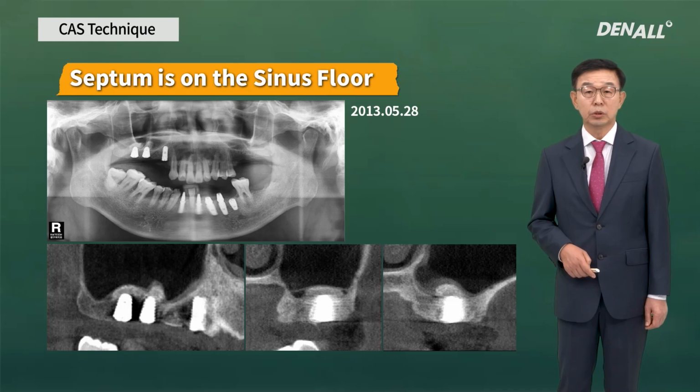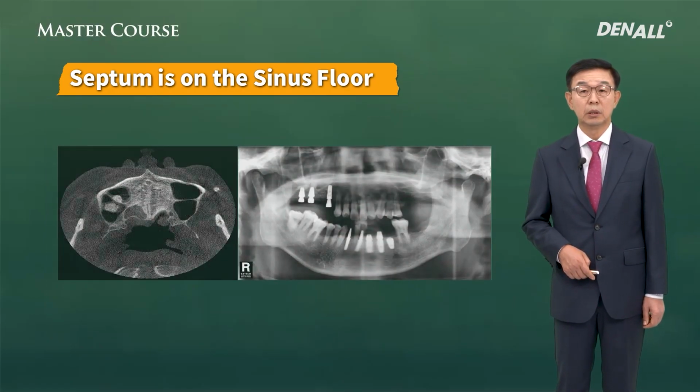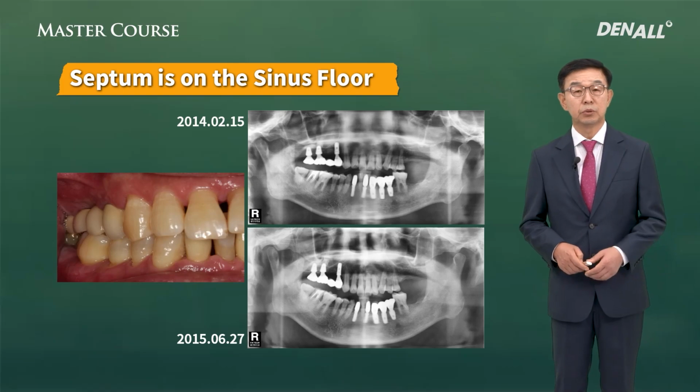And this is after surgery. This is after final prosthesis delivery. Even after 5 years, this is well maintained.